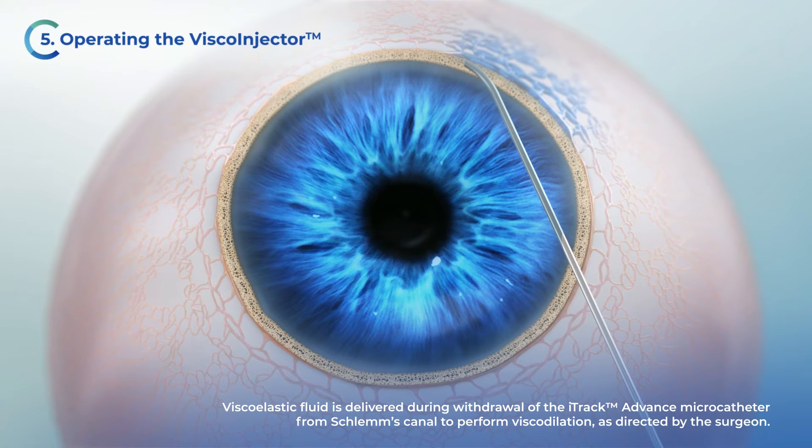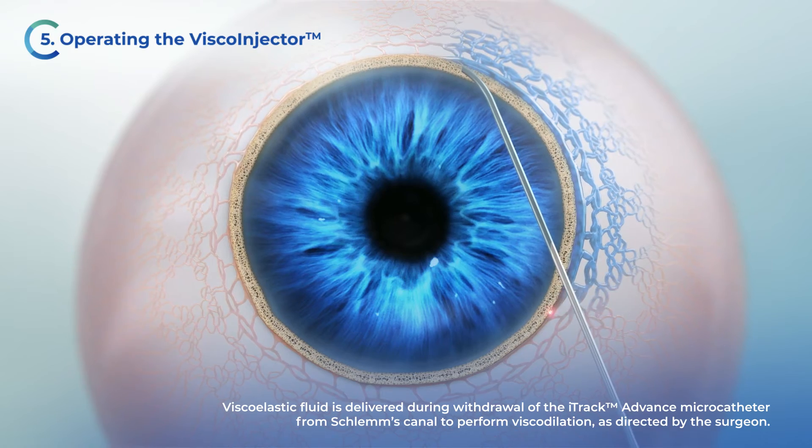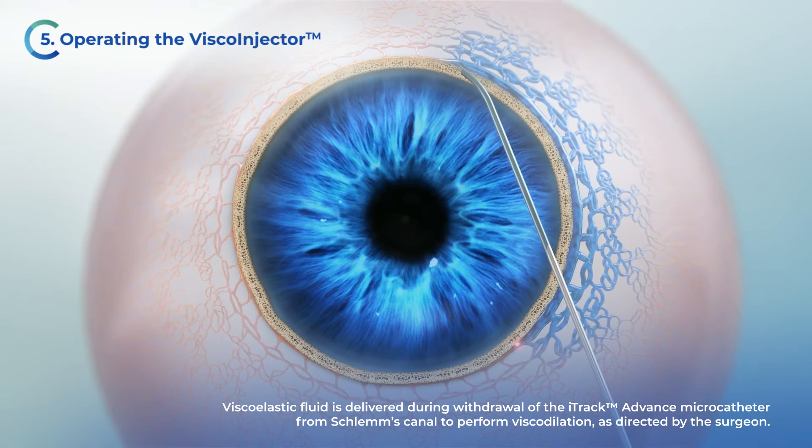Viscoelastic fluid is delivered during withdrawal of the iTrack Advance microcatheter from Schlemm's canal to perform viscodilation, as directed by the surgeon.